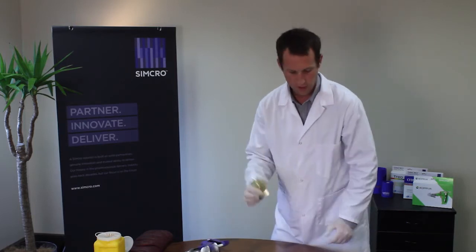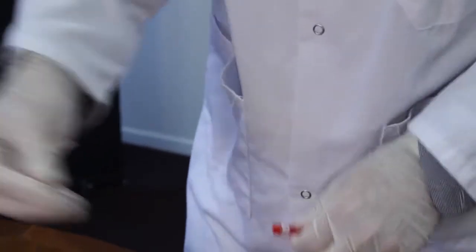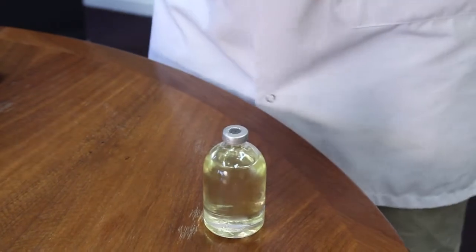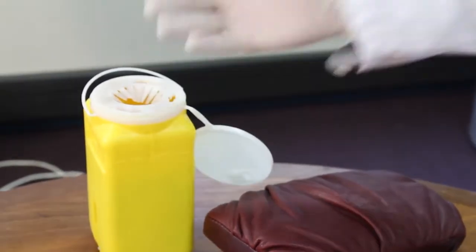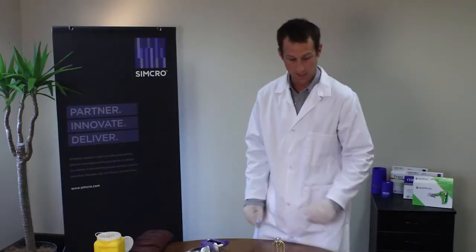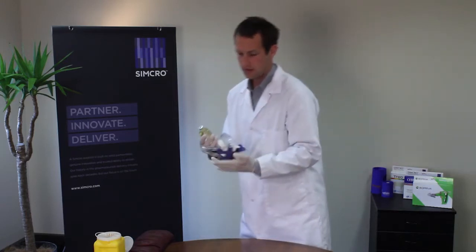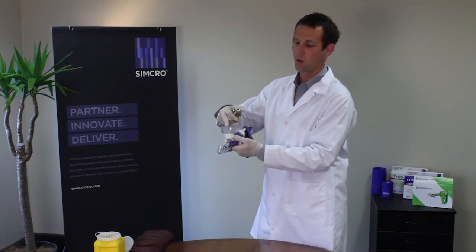Take the bottle we're going to use and take a needle. We pierce the bung. The needle goes into our shaft — we always dispose of that first needle as best practice, just in case there's some bung stuck in the needle. Then take our bottle.